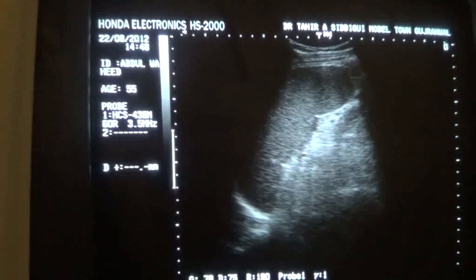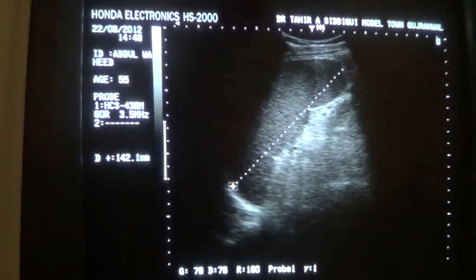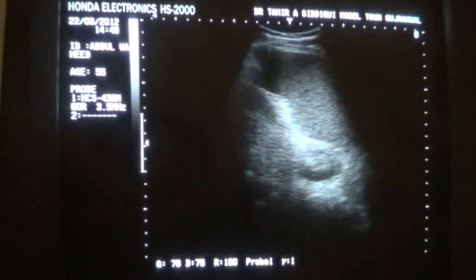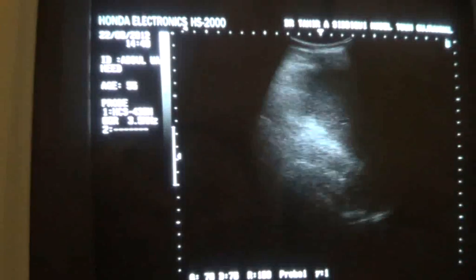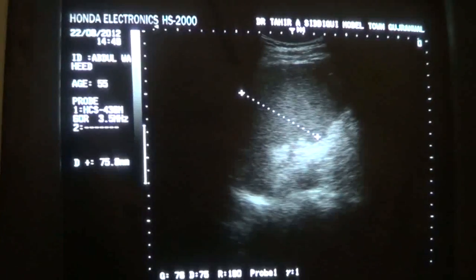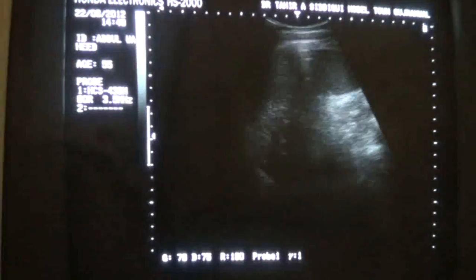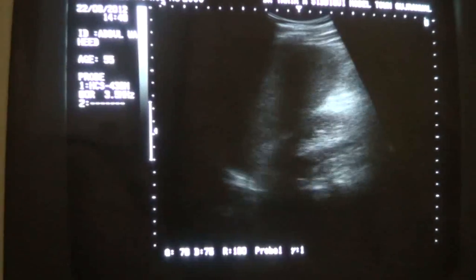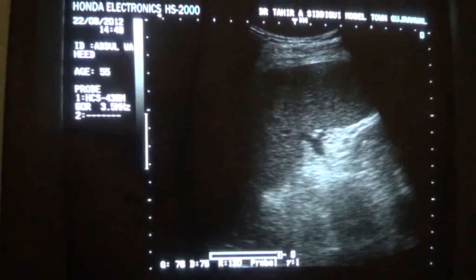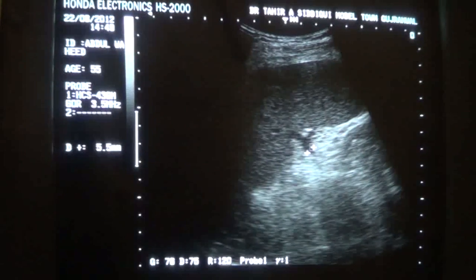Now let's see the spleen. The spleen from pole to pole — normal should not exceed more than 12 cm. In this patient it measures 14.2 cm, so the spleen is enlarged from pole to pole. Now let's see its measurement in width — it should not exceed more than 6 cm and it measures approximately 7.5 cm. So the spleen is enlarged in width as well as in anterior-posterior diameter. The left kidney is seen. The splenic vein measures 5.5 mm.